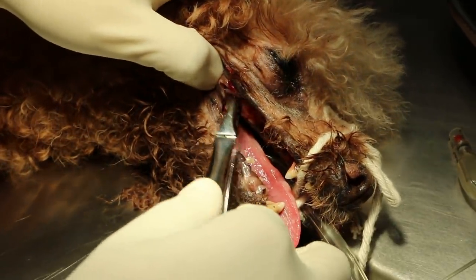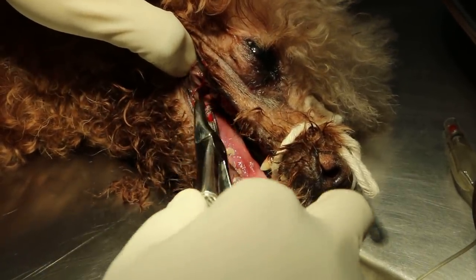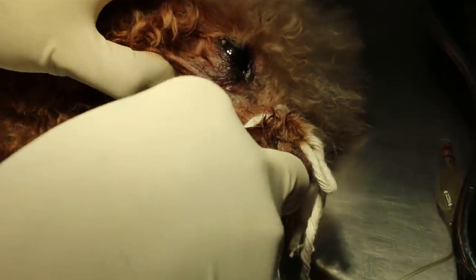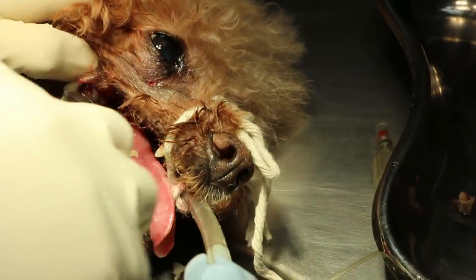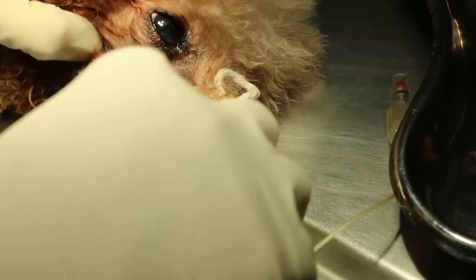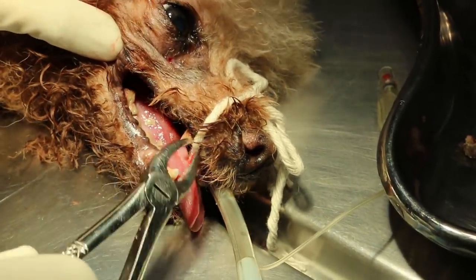No more. Check carefully — no more. We go at the top first. Nothing. There's an M2 — so just extract M2, write down M2. Now we go to the canine. Take off and loosen the string.